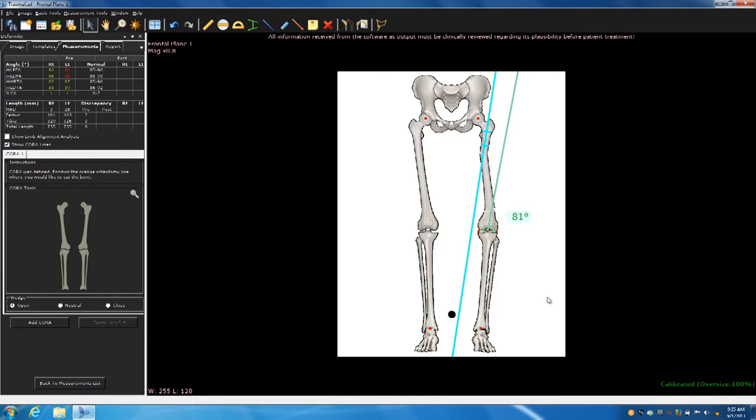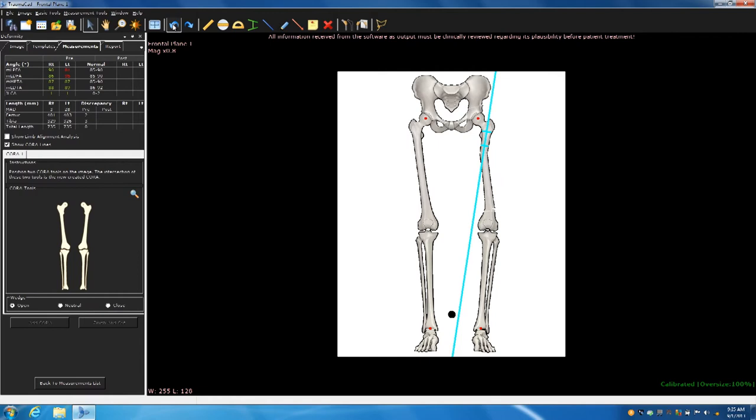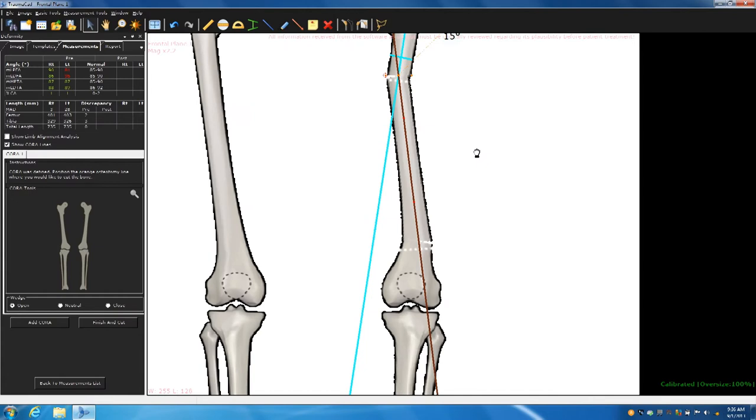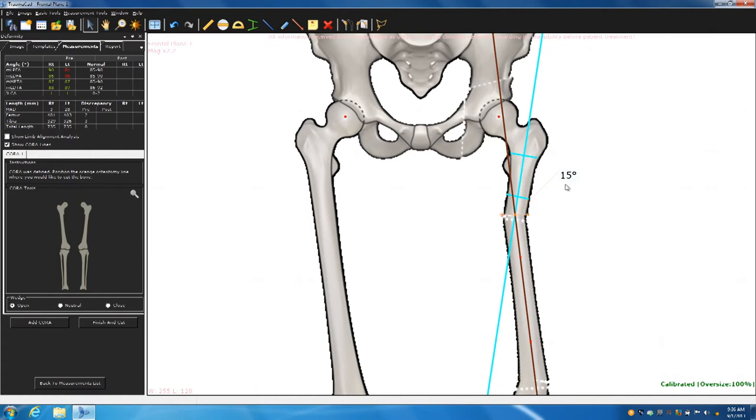The other thing that I should have said at the very beginning is the lines that you created for your limb analysis are the same lines that the computer uses to create these angles. So zoom in and make sure that you agree with this line. If not, you can manipulate a little bit and say, this is a better distal femoral joint line. And so if we look, what's happening, where are these two lines meeting? They're going to meet somewhere, as John said, probably in China, right? So what does that tell you? You don't have an apex that's obvious, so that means something's hidden. And you have a double level deformity.